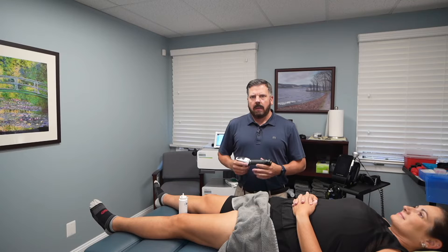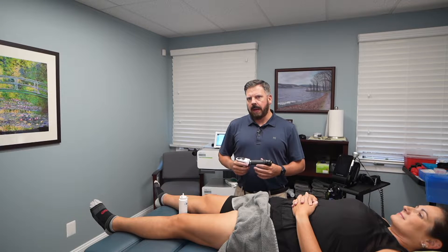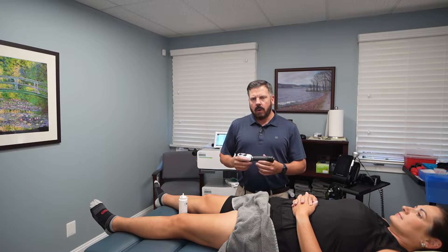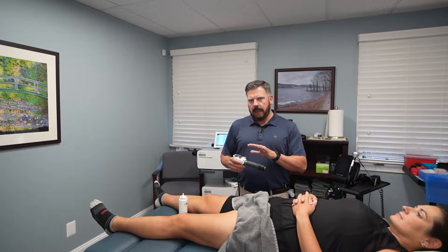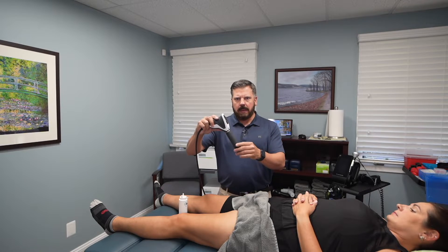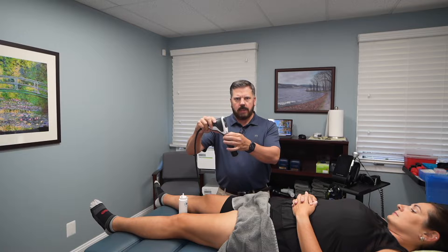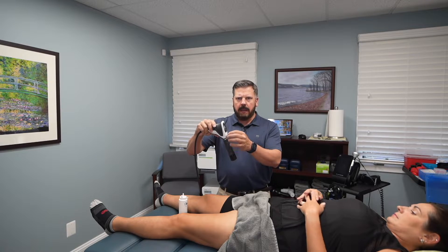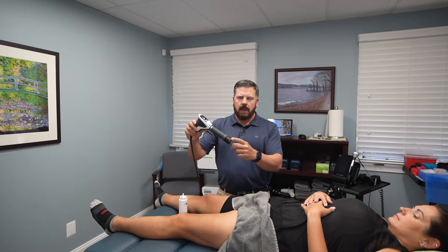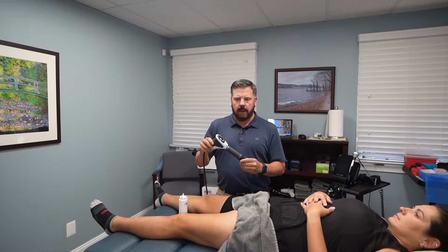I'm going to demonstrate the two different types of shockwave and show you how to use them in combination. This is what the radial treatment handle looks like — there's basically a little projectile in here. When I turn it on, it sends air pressure which sends the projectile into the treatment tip and sends an acoustic sound wave into the injured area.